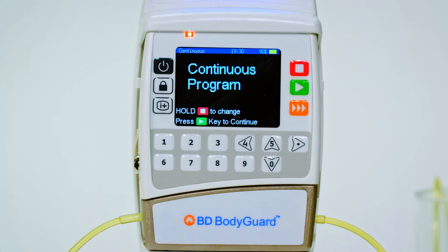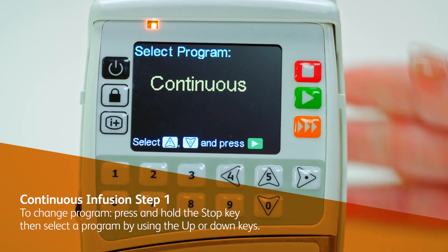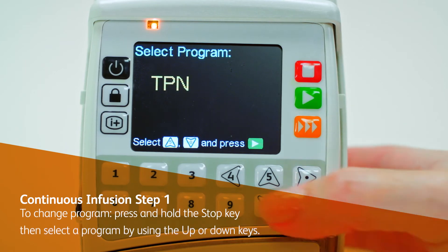When you first turn on the pump, the default program will display. Immediately press and hold the stop key. Use the up and down keys to cycle through available program options. To change program, press and hold the stop key, then select a program using the up or down keys.